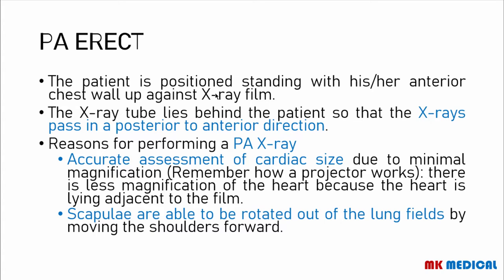Now, the reason why we want to do a PA x-ray is because we want to have an accurate assessment of the cardiac size. Now, I'll explain this by using an analogy with everyday life. I'm sure each of you watching these videos have used a projector before. The one that they use in the cinema, the one that you use probably in your class, or wherever it may be. So what would happen if you get the projector and put it closer to the board? Would the image that's seen on the board be smaller or would it be larger?